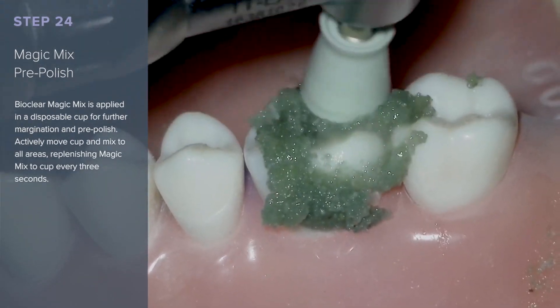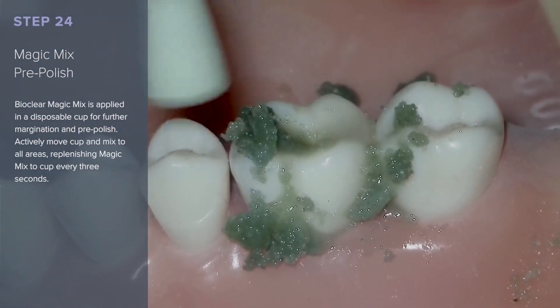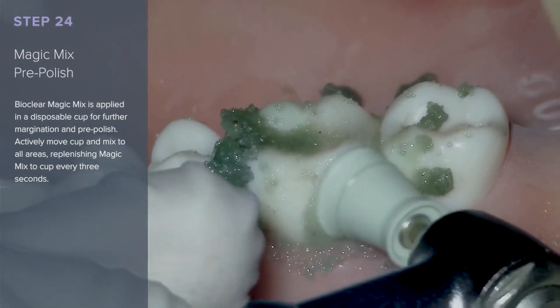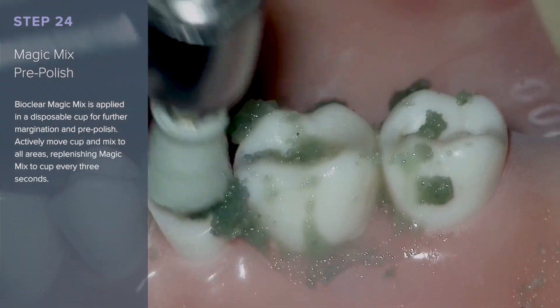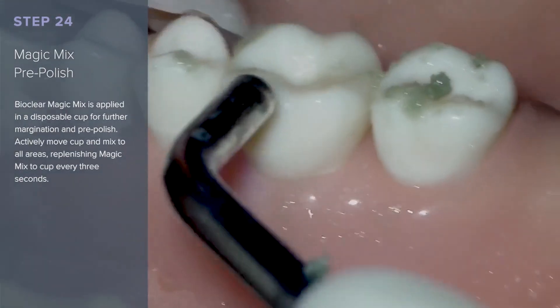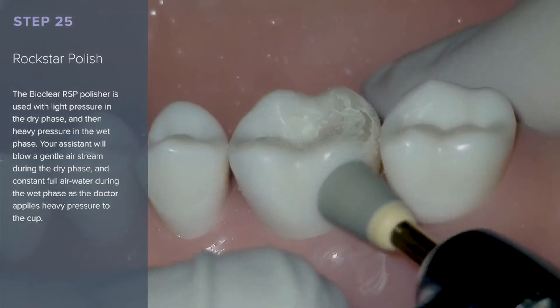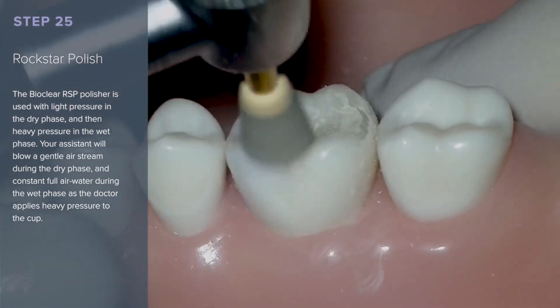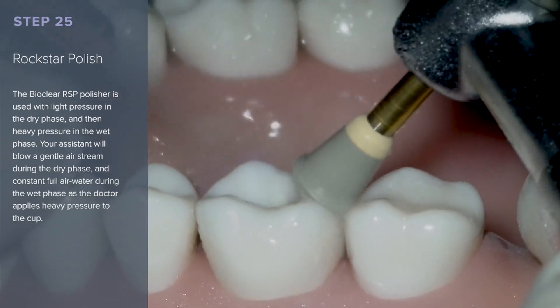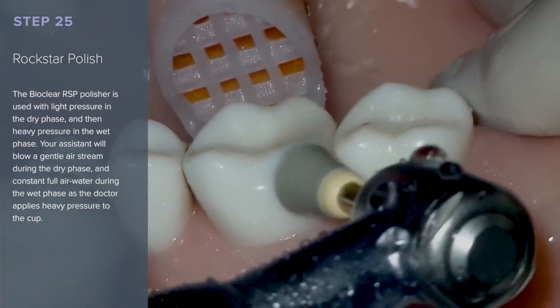Bioclear Magic Mix is applied in a disposable cup for further margination and pre-polishing. Actively move the cup and the mix to all areas, replenishing Magic Mix to the cup every 3 seconds. The Bioclear RSP polisher is used with light pressure in the dry phase and then heavy pressure in the wet phase. The assistant will blow a gentle air stream during the dry phase and constant full air-water during the wet phase as the doctor applies heavy pressure to the cup.